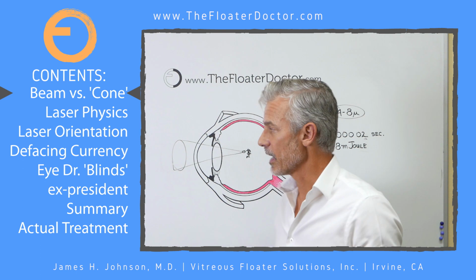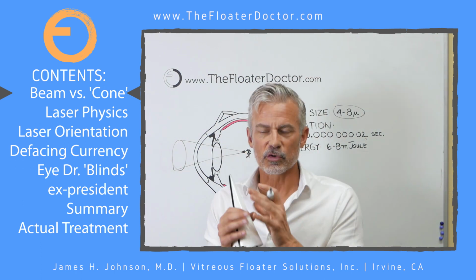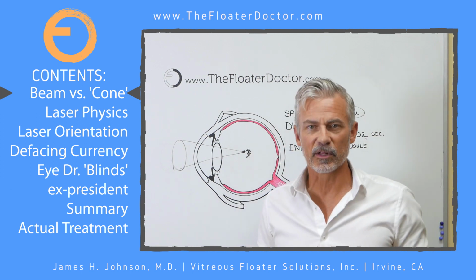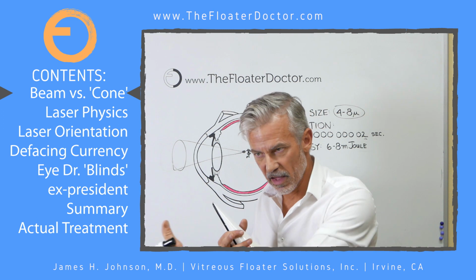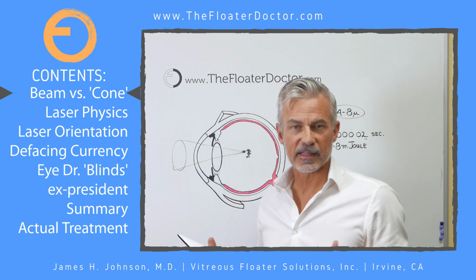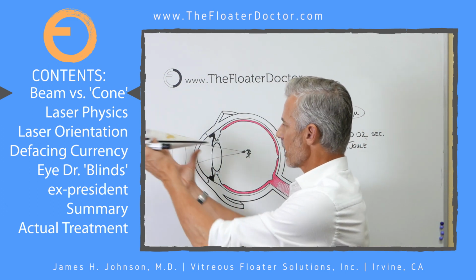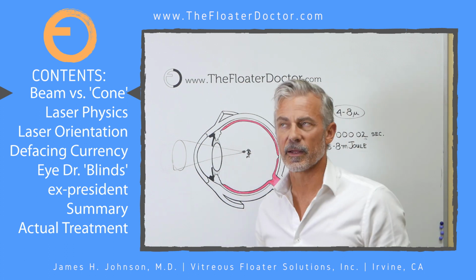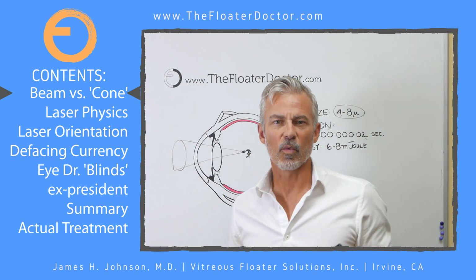It's very, very small. Now, truth be told, there's a little bundle of, we'll just call it shock wave energy surrounding it, but even that is still less than a millimeter. The point is that the energy is not along a line, it is a point. And my responsibility as the laser operator is to know where that point is at all times, and I'm basically moving the entire laser, but basically putting that cone apex, the cone point, where I want it.